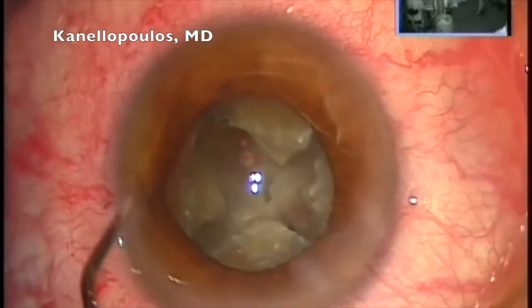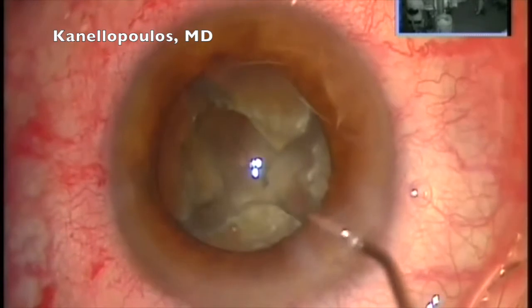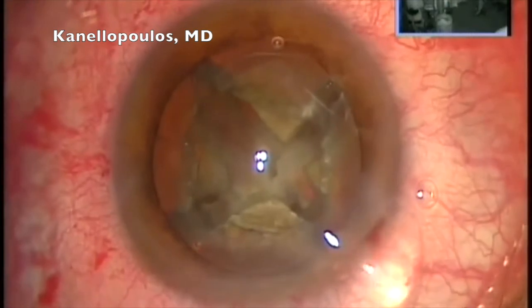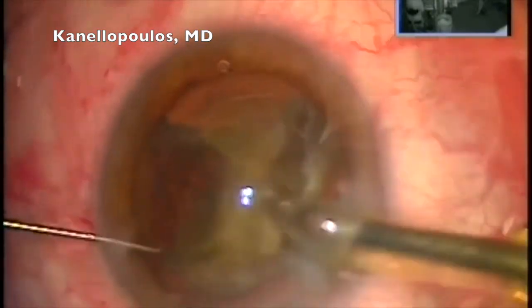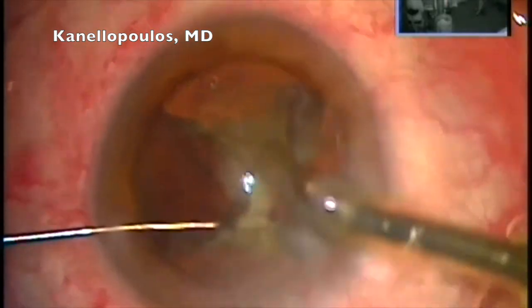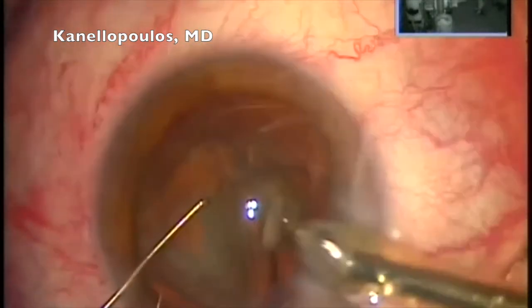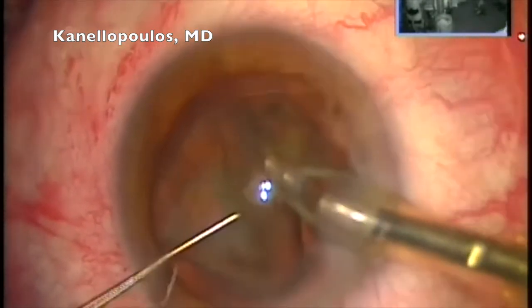My pupil is down, trapped a little bit with the paracentesis. So a good time to use some epinephrine — or adrenaline, if you like to call it that — and we'll see how nicely the pupil dilates just enough for a better view. A second tube of viscoelastic. Very careful here since we're going to use quite a bit of energy — I'm hoping to be under 200 joules total. But with repeated filling of the chamber with viscoelastic, we end up with minimal cell damage. Usually the eyes are pristine the next day. We're down to the last quad.